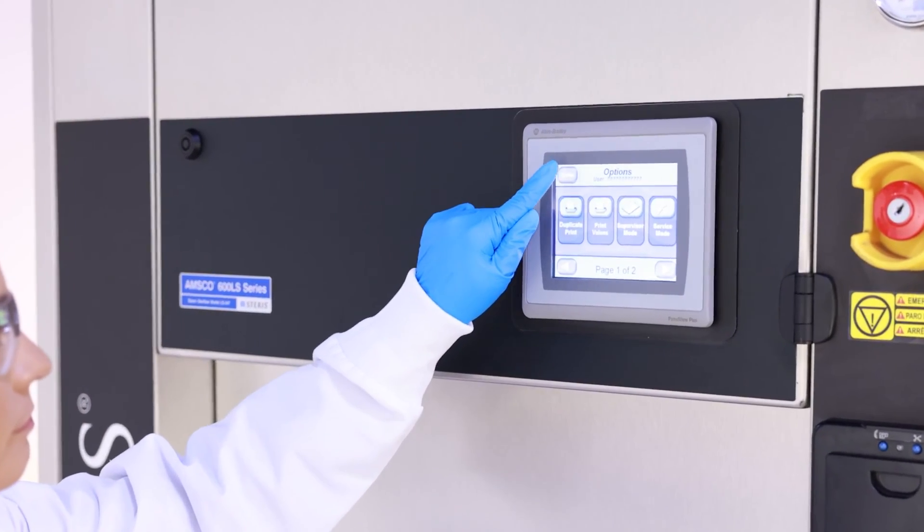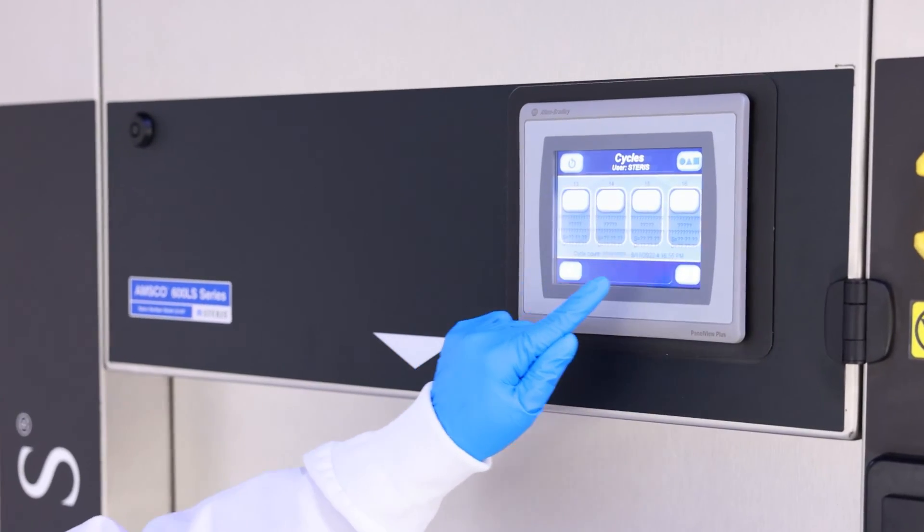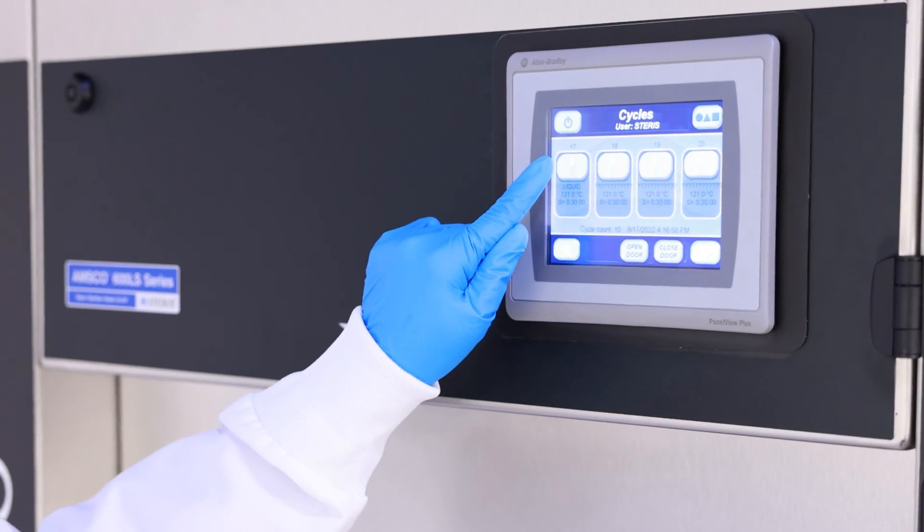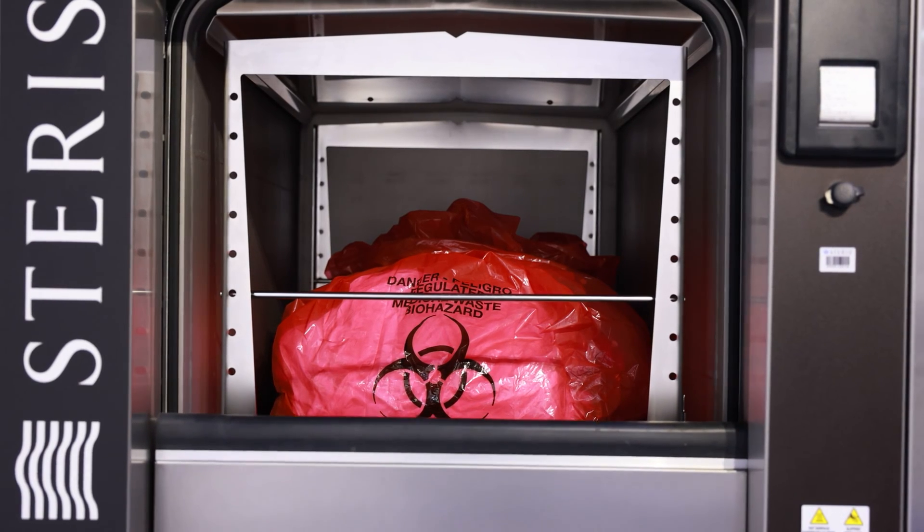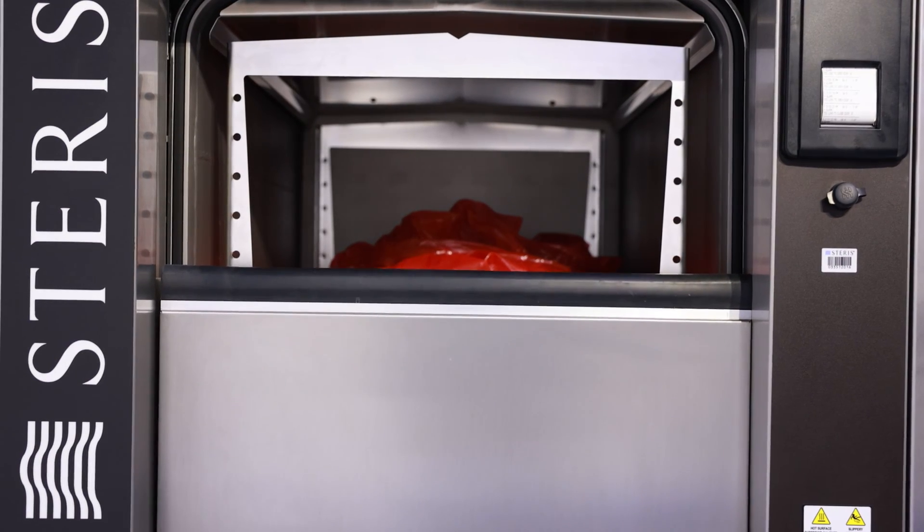All AMSCO 600LS are equipped with standard pre-vacuum, liquid and gravity factory preset, and programmable cycles as well as a cycle designed to efficiently process laboratory waste bags.